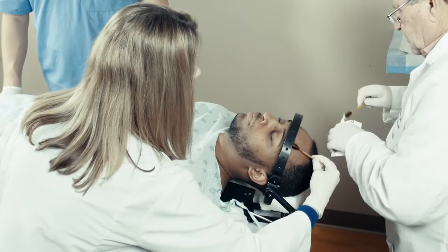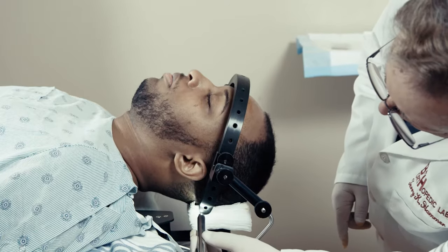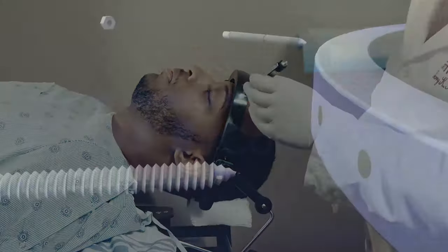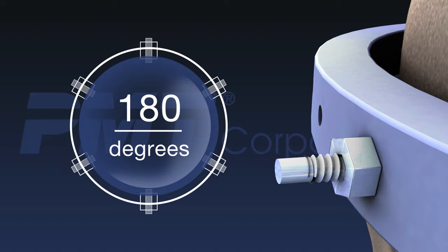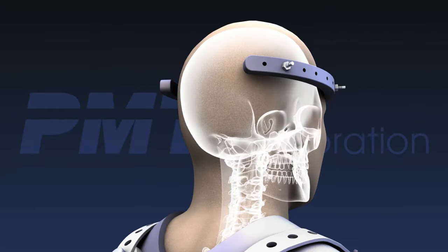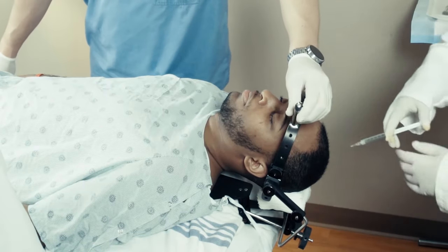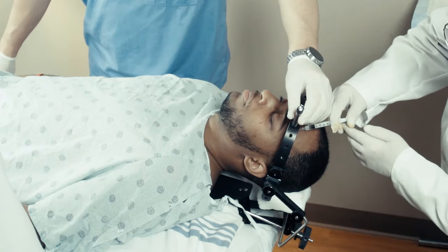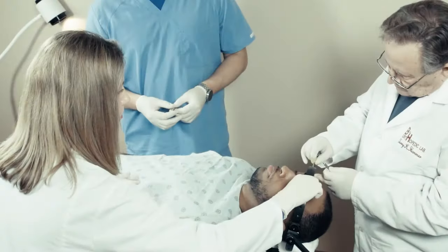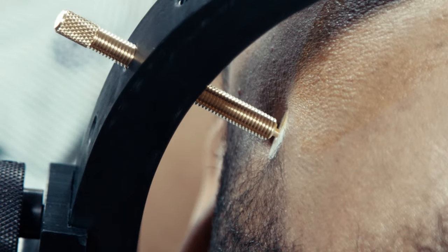After shaving the hair and with the ring held in proper position, swab the head with betadine. Use an exam light to locate the pin sites. Pin sites should be at a diagonal, as close to a 180-degree angle as possible. Posteriorly, the pins are placed in the relatively thick occipital bones. The skin beneath the appropriate holes is anesthetized with 1% lidocaine and epinephrine in a sterile fashion. For stability during pin insertion, the ring may be held manually or plastic-capped positioning pins may be inserted through vacant holes in the ring.